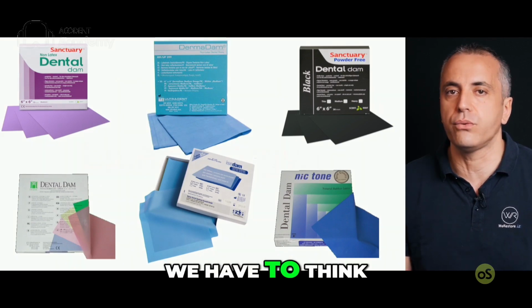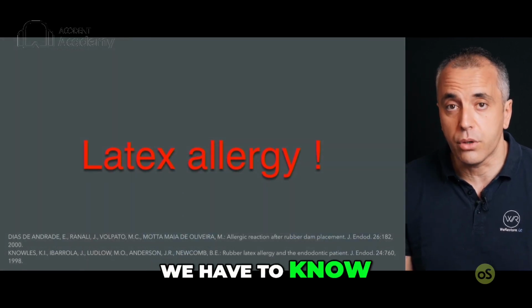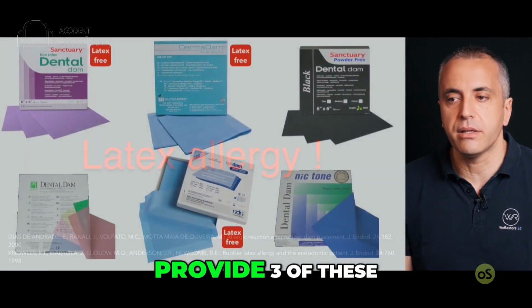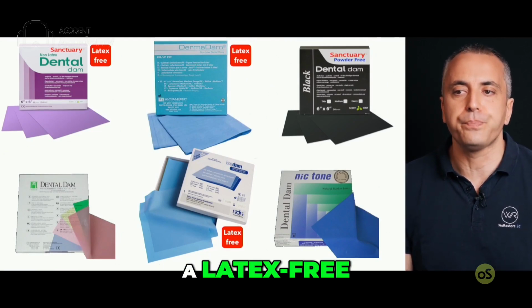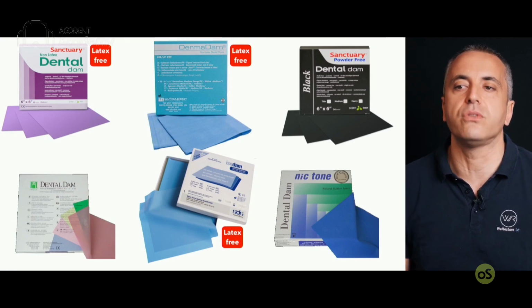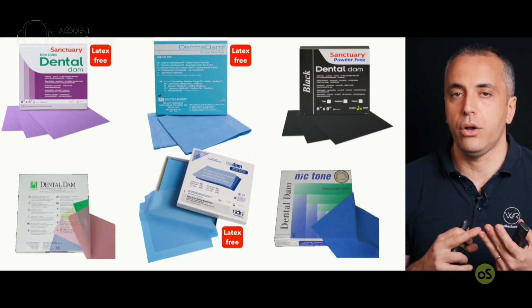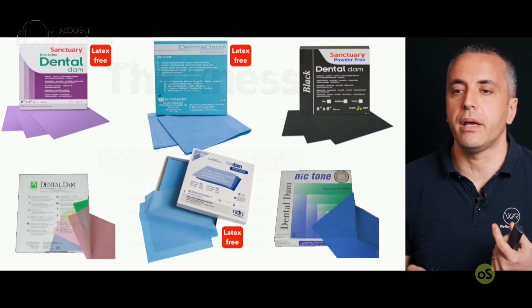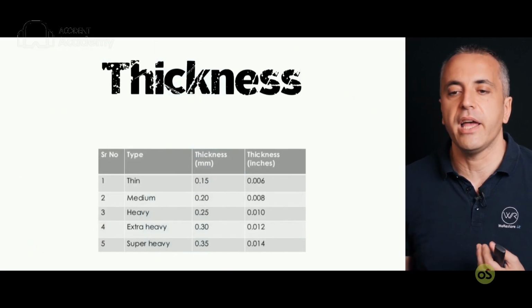Of course, we have to think about our patients. If there is a latex allergy, we have to know. And so we can provide them; 3 of these, for example, are latex free. So you can select a latex free rubber dam. And of course, to choose a rubber dam, you can think about latex free or not latex free, thickness, color, and for example, this is thickness. There are thin, medium, heavy, extra heavy, and super heavy.